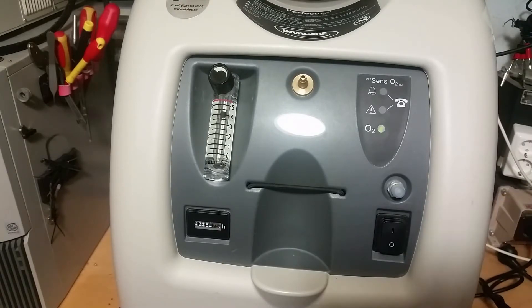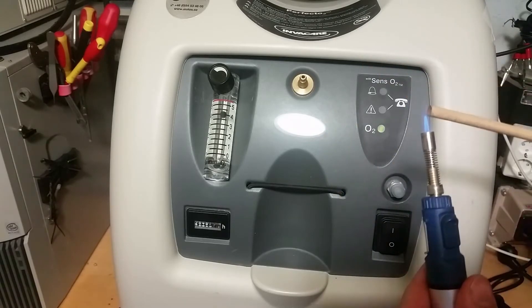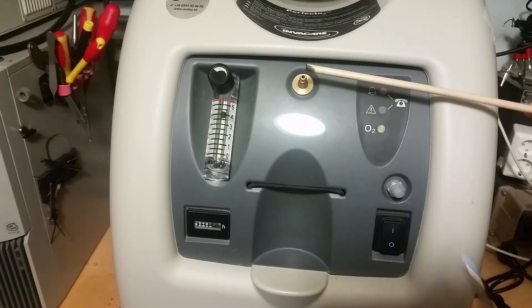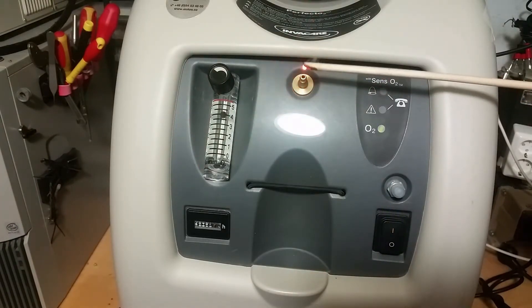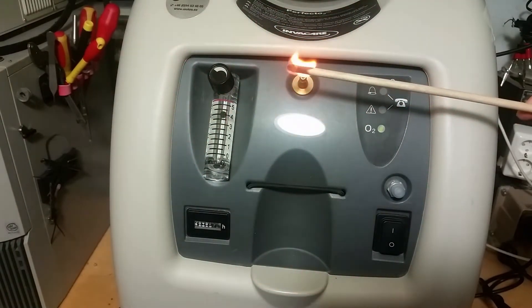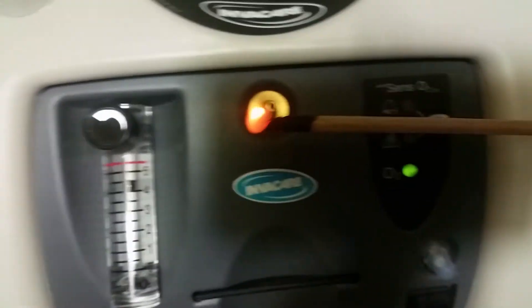You can hear the sound when it changes the sieve beds. And now the best part — flame test. Do not try this at home or anywhere else. Yeah, very powerful, it's like welding the wood.